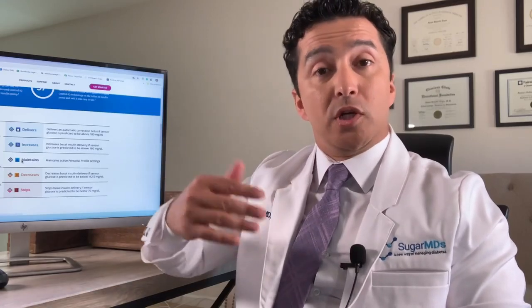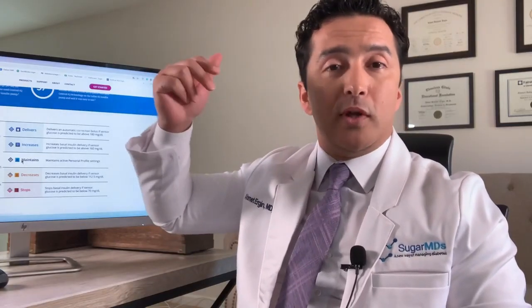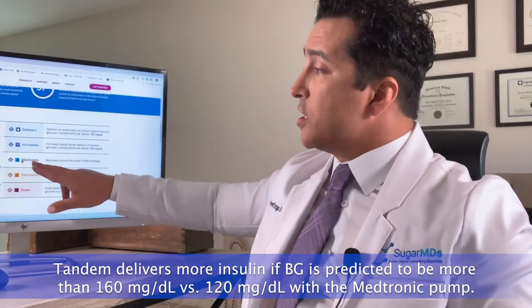When the Dexcom predicts you'll go below 70, the Tandem pump shuts off. With Medtronic, it shuts off at 20 above the threshold — so if you set your low threshold to 90, the pump will shut off insulin at 110. You have to be careful, because if set that way you may end up with high blood sugars with the Medtronic pump if the settings are not configured correctly.